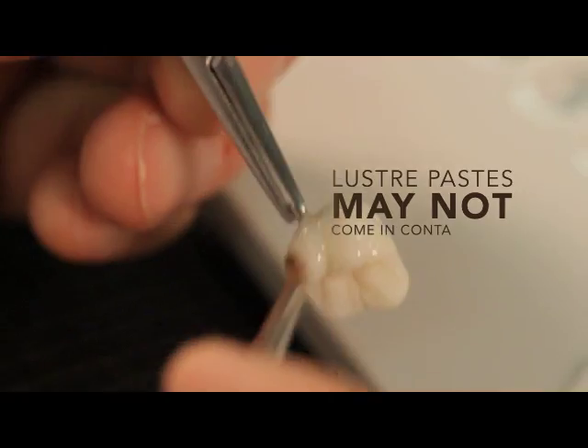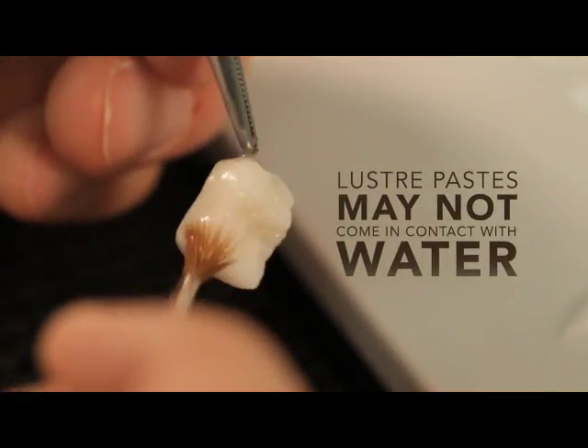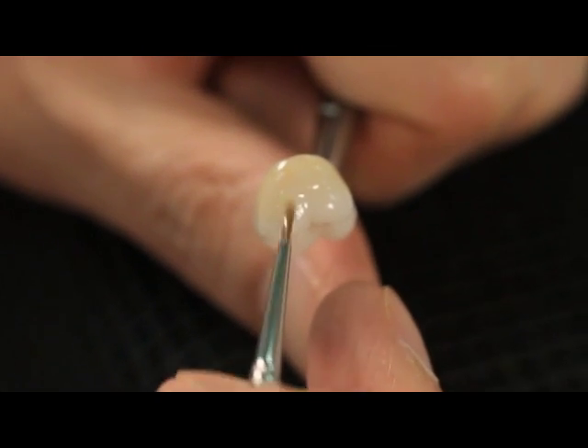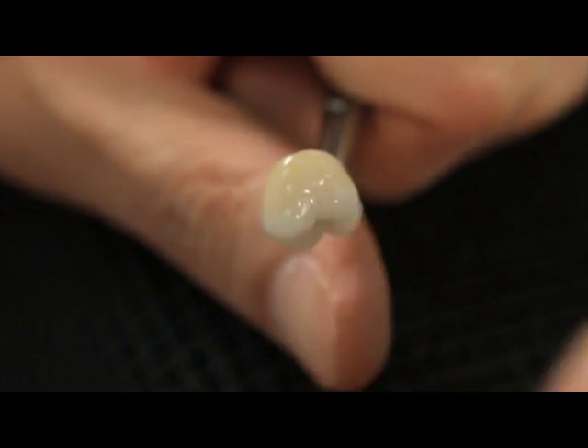Note: these Lustre Paste may not come in contact with water. The requested Vita Pan Classic shade is created by a more or less intensive application of the Lustre Paste Body A through D.